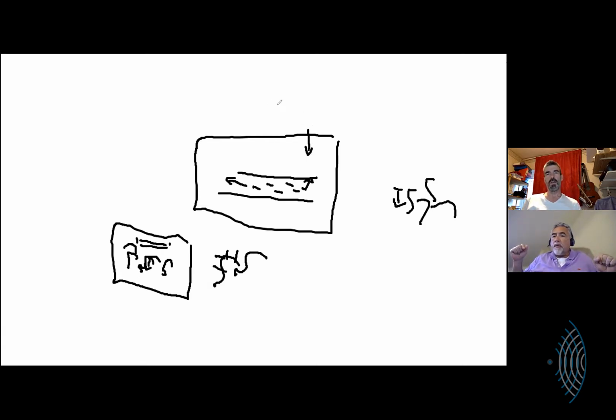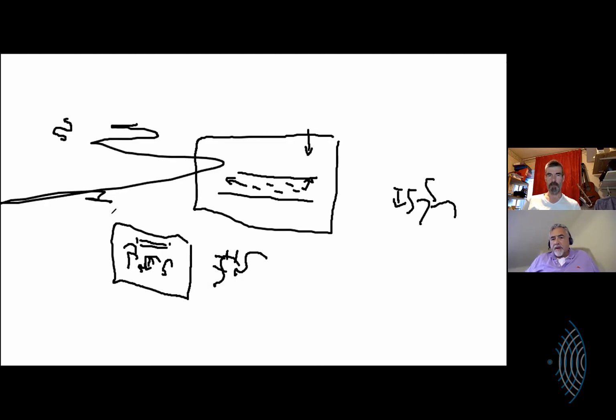We talked last time about your anatomical, your grayscale being 3 cycles. Do you remember we talked about this? Yes. You have boom, boom, boom. And that's it. A pulse, a very short pulse, lasting 3 10-millionths of a second. So a tiny, tiny, tiny pulse that creates your grayscale picture.